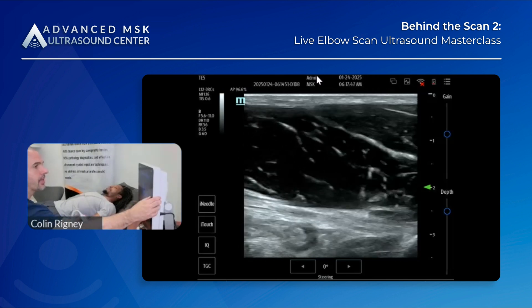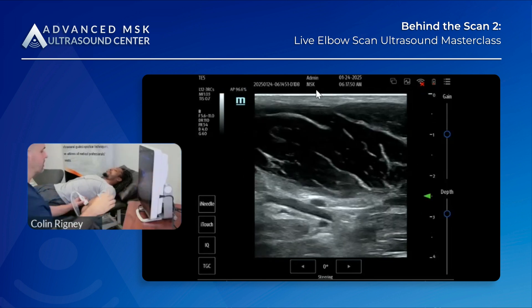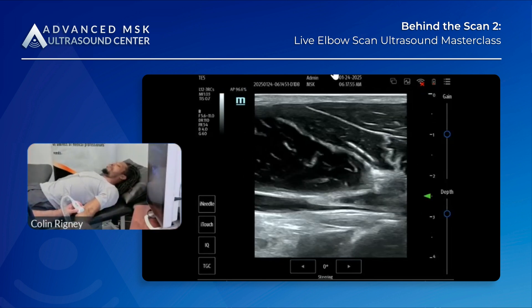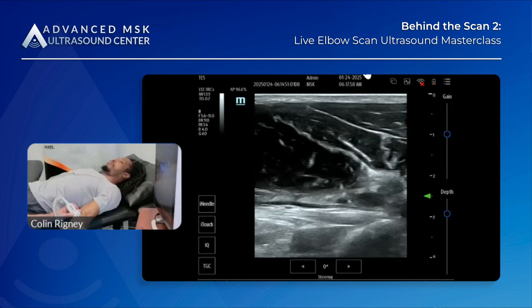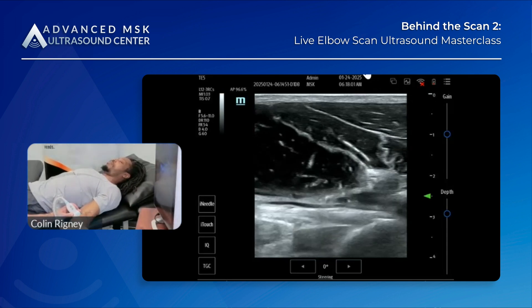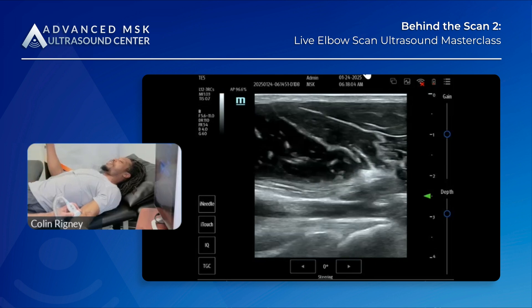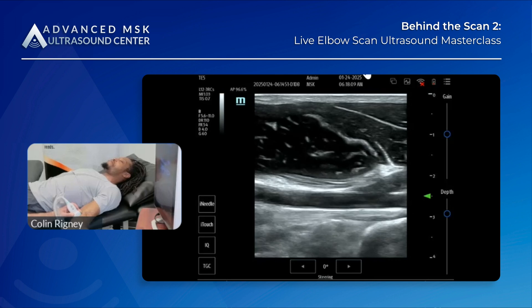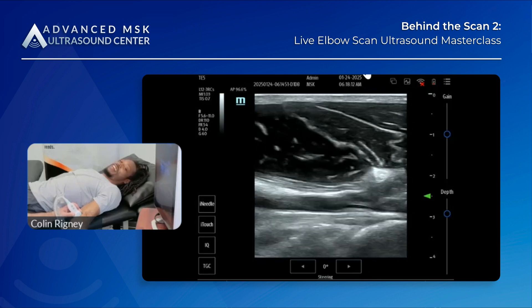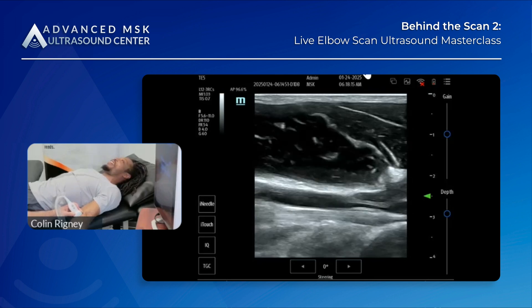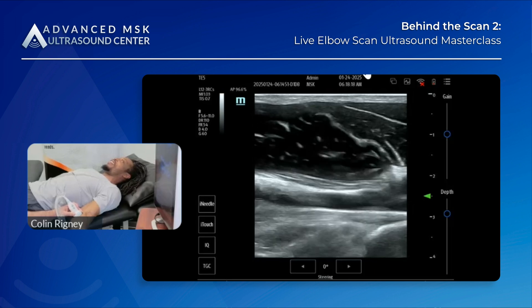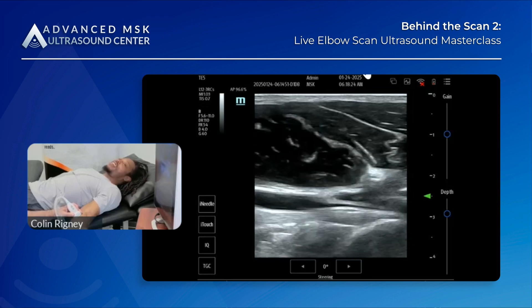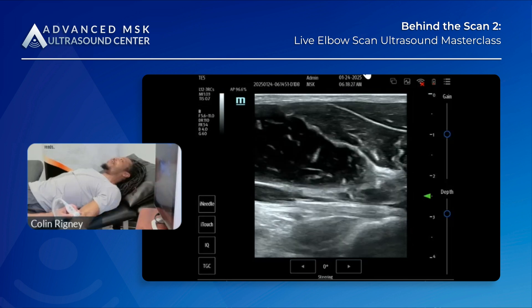Let me go a little more depth here. The image is looking good. Some people are asking to zoom in but we've got what we've got — next time. I'm zoomed into Julius's elbow. Julius had a long day today and he very generously donated his time here tonight with us. Everybody give Julius a hand clap or a thumbs up. Let's freeze it up.